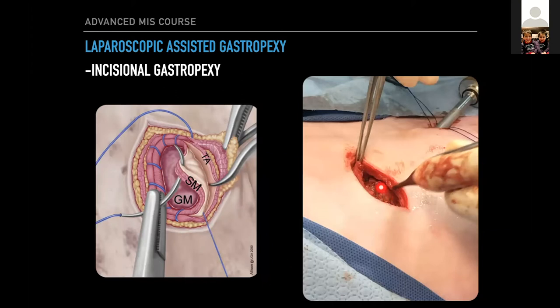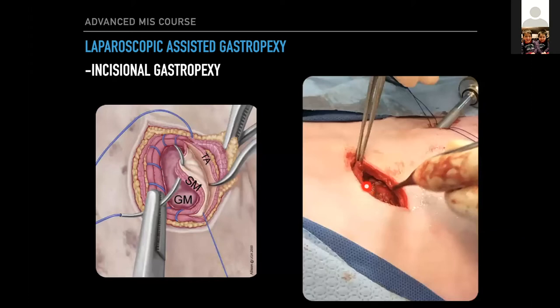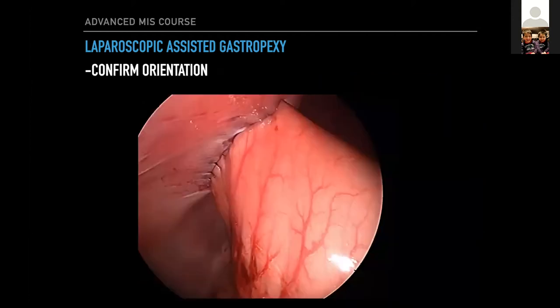You can kind of see the submucosa and mucosa pooching through. We're suturing the transversus abdominis to that seromuscular layer exactly as you would open — nothing fancy. I suture the cranial incisions, then the caudal incisions, and I tag the external and internal abdominal oblique layers because I want to be absolutely meticulous in closing — this is a seroma-prone area. What's nice about the assisted technique is that once you've sutured the transversus abdominis to the seromuscular layer, you've created a seal and can re-insufflate to verify orientation.